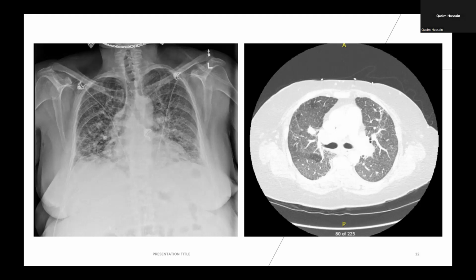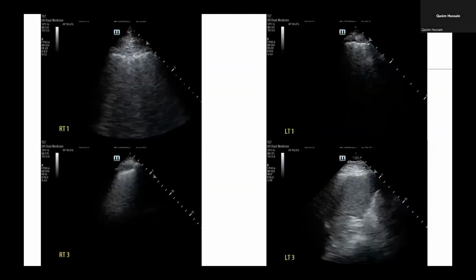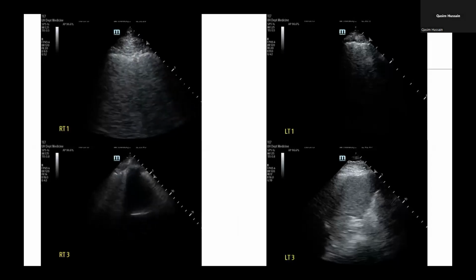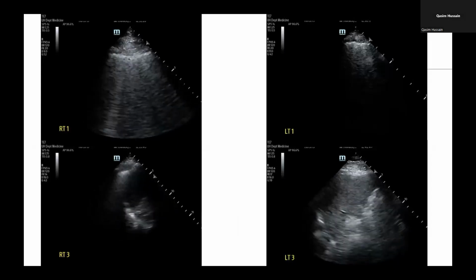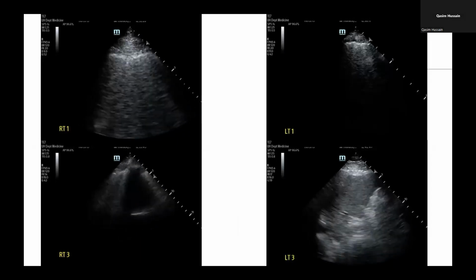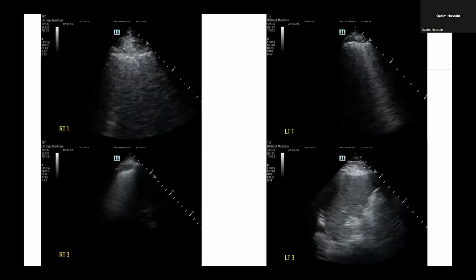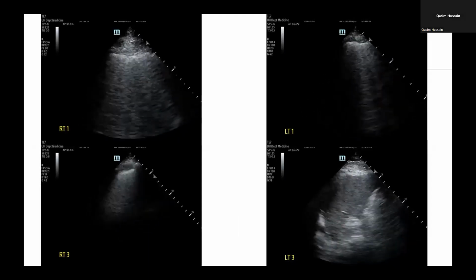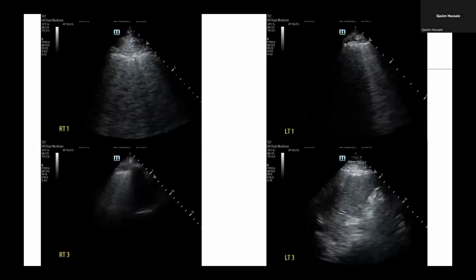So that's where we got involved. So we went ahead and performed a lung ultrasound on her to start. And as expected, I'll give it a second to let it load, but spoiler alert, she's gonna have B-lines essentially everywhere. And there's no clear effusions on the costal views at the bottom. But diffuse B-lines, but it's hard to tell.